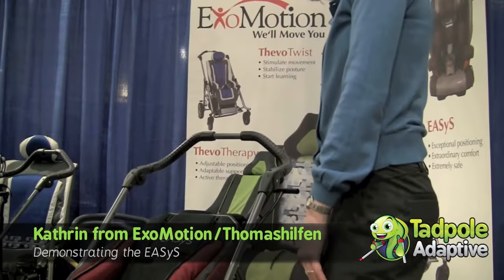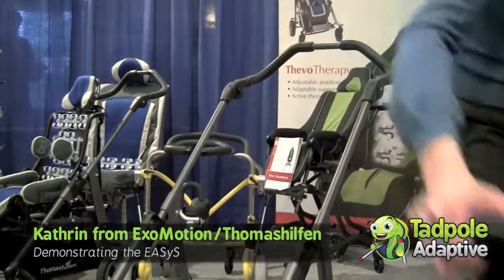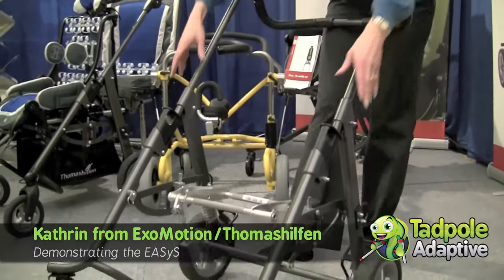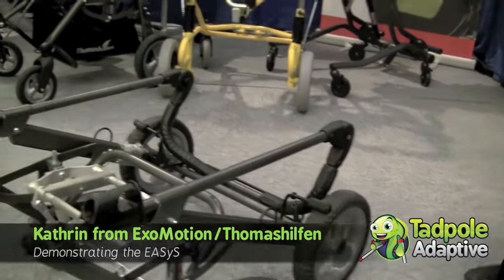It's very easy to fold the Eases. Take off the seat first. And then just very simple, like a regular stroller, fold it. And with that you can easily put it in your car.